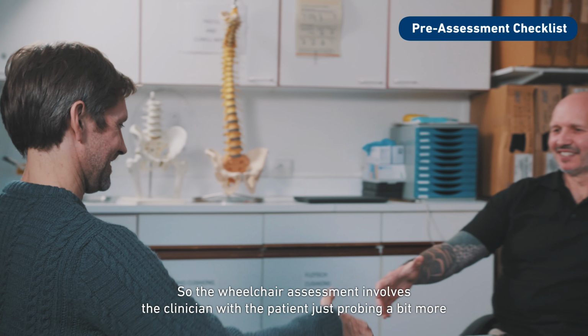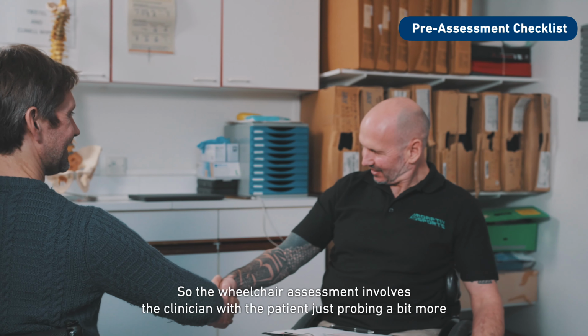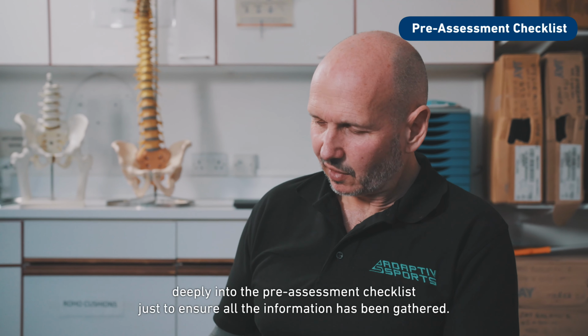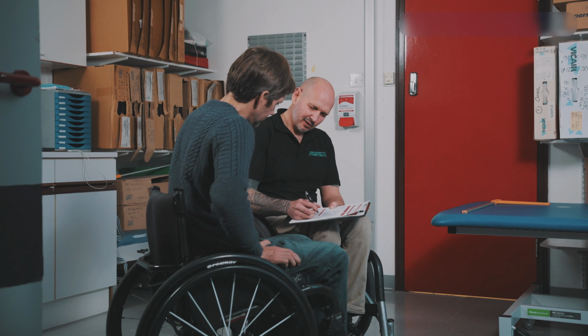So the wheelchair assessment involves the clinician with the patient just probing a bit more deeply into the pre-assessment checklist to ensure all the information has been gathered.